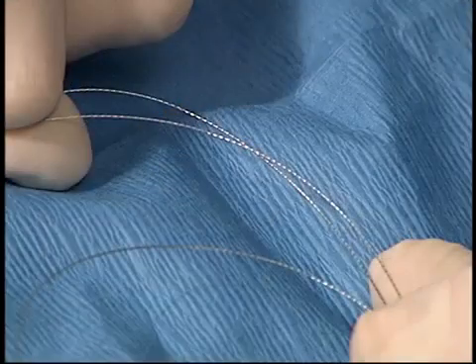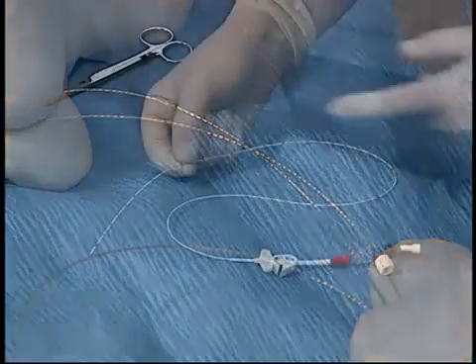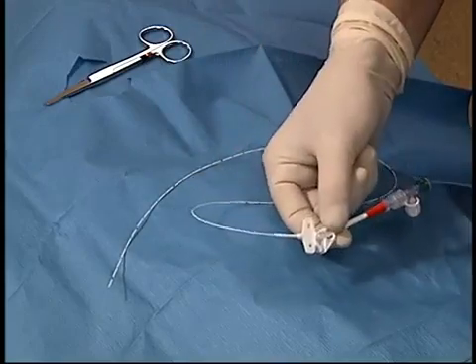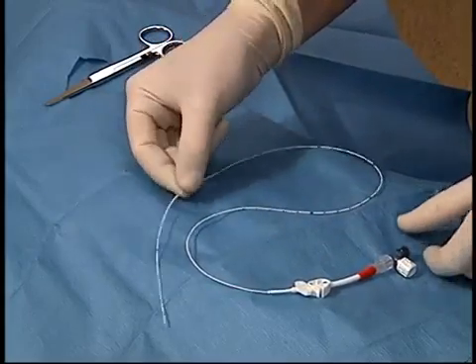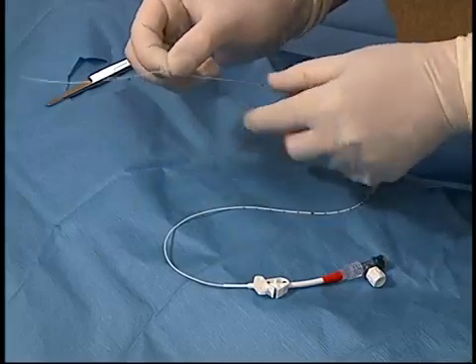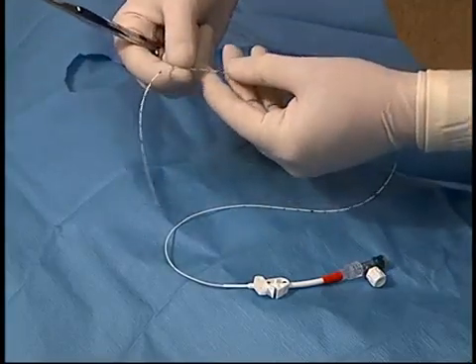The catheter has an inner stylet which is a woven wire that provides rigidity for placement. These catheters can be cut if they are too long. The inner wire, which cannot be cut because of its woven nature, must be retracted until the catheter is of the suitable length, and then the end of the catheter is cut. It's extremely important to remember not to cut the wire.